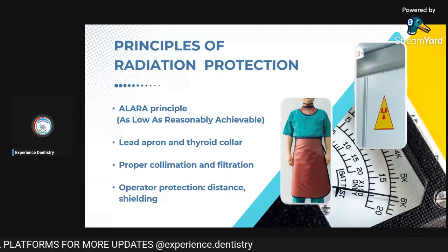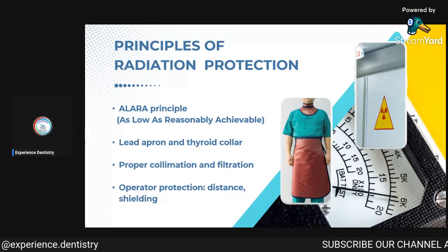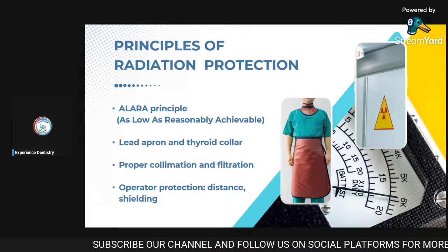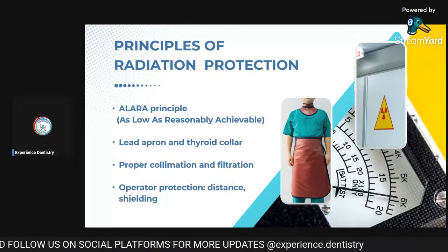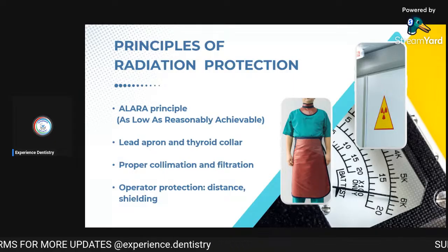Okay, so do make sure, and I know that most people don't incorporate these two things in their normal practice, but you should do an X-ray with these two things. You should wear them yourself as well, and you should place these on your patient as well. Okay, so there is a proper collimation and filtration process.